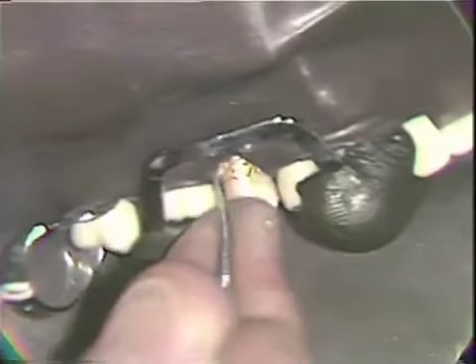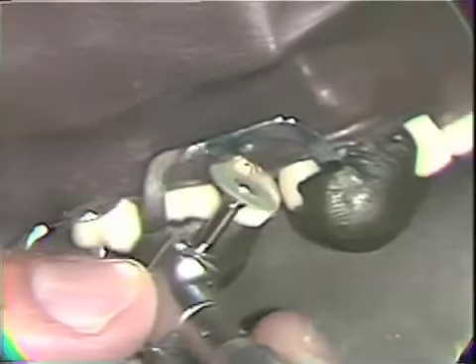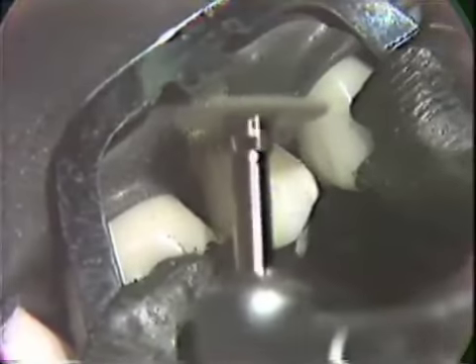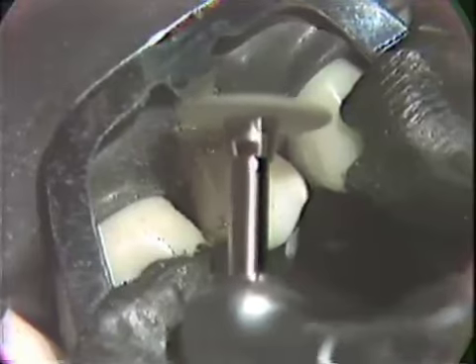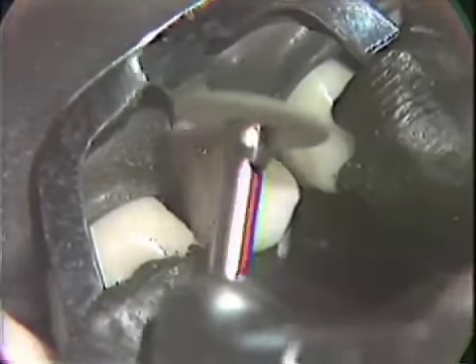We can then move into the use of the rotary instruments, and we'll begin on this mesial segment using the fine sand disc to initiate the contour in this area. If there was gross contour, we would be utilizing perhaps the carrot-shaped stone to do this reduction.